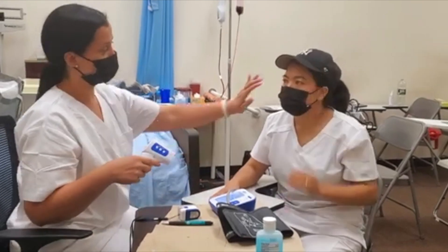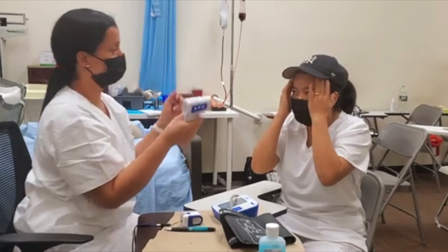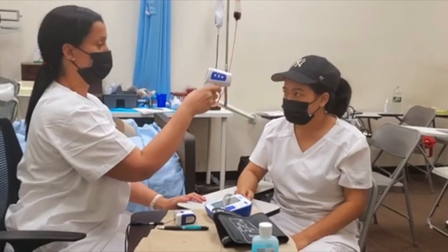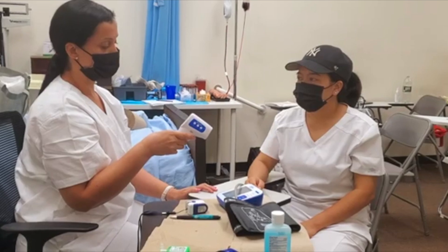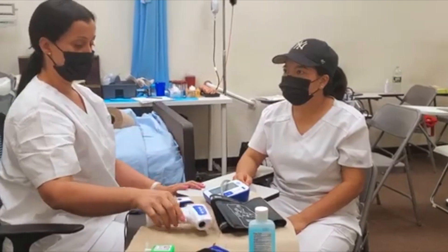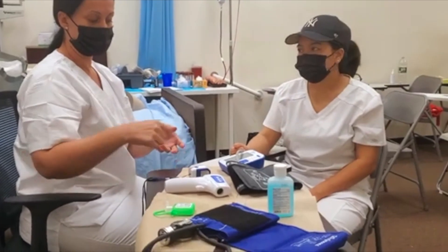We're going to make sure this part here is clean and dry — out of hair — and just press it so we can have an accurate reading. The temperature is 97.3, which is normal. The normal temperature for the forehead is between 97.3 and 99 degrees.